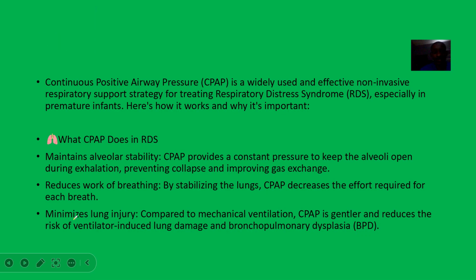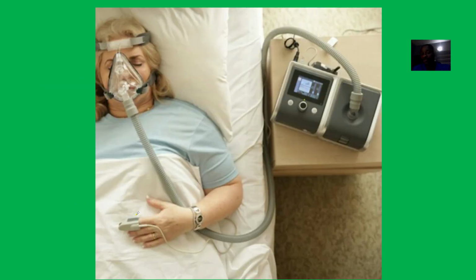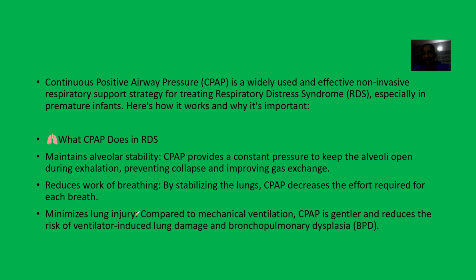So continuous positive airway pressure is a widely used and effective non-invasive respiratory support strategy. It is used for what? Managing respiratory distress syndrome. In respiratory distress syndrome, just like the name implies, one of the most important issues that the patient is facing is difficulty in breathing.